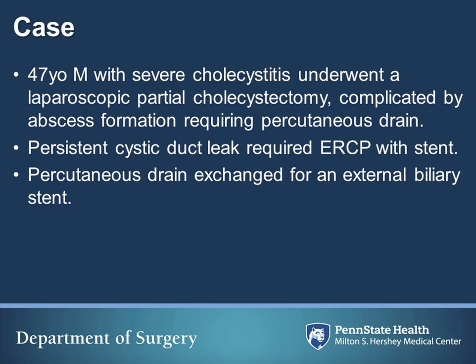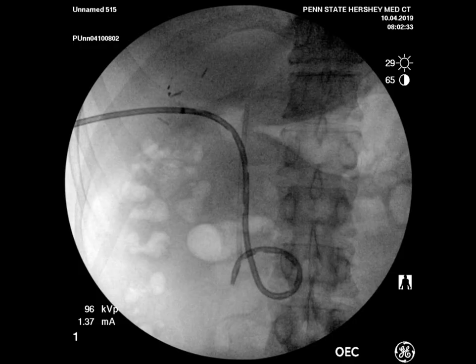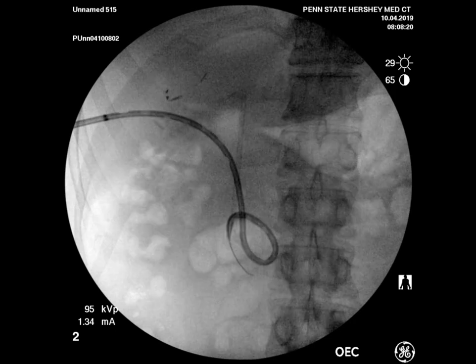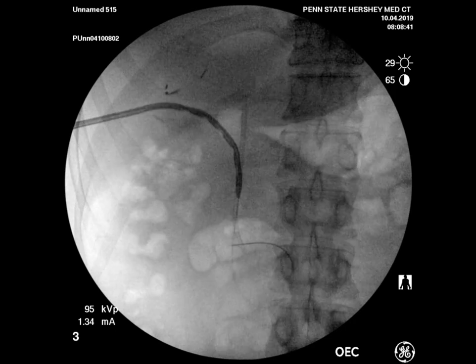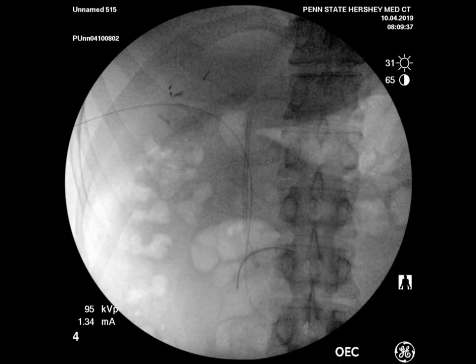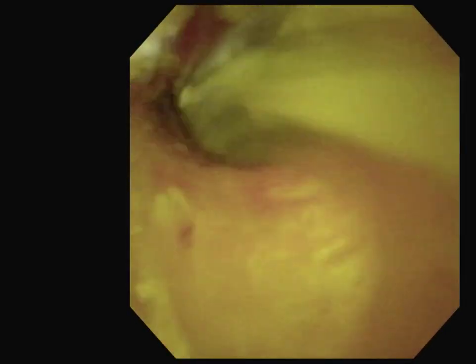After further discussion, we decided to try an endoscopic intervention first. We proceeded with percutaneous endoscopy via the drain tract. The drain was then accessed with a wire until a loop was formed in the duodenum, and the drain was removed. Over the wire, we advanced an Olympus UFV ultra-slim ureteroscope into the drain tract.